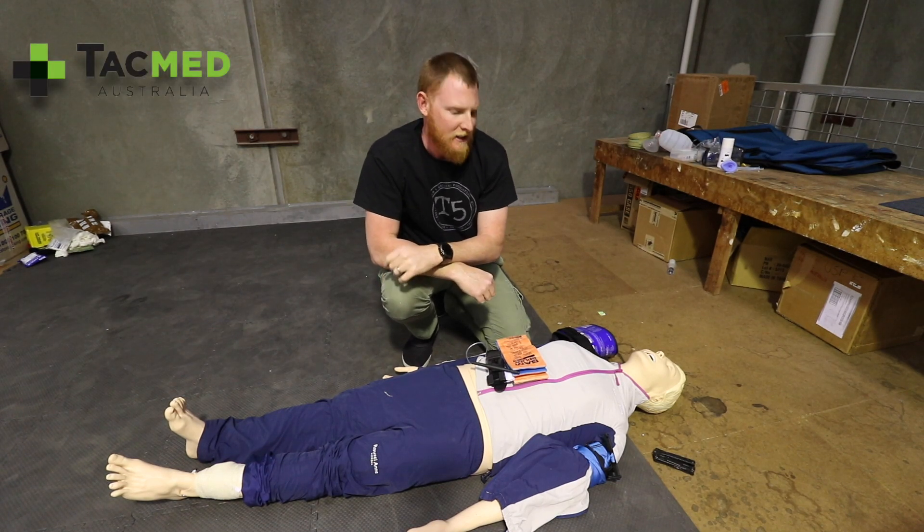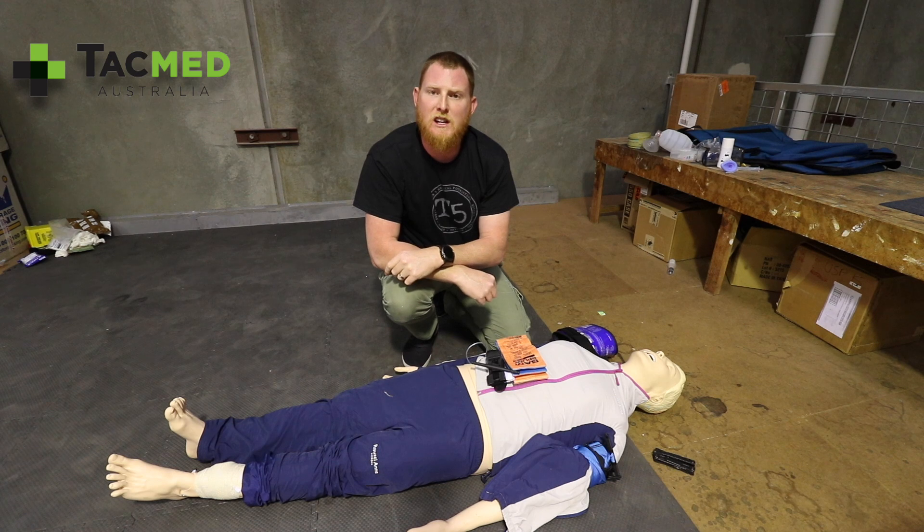G'day guys, Jeremy from TACMED Australia. Today I'm going to run through an improvised pelvic splint.